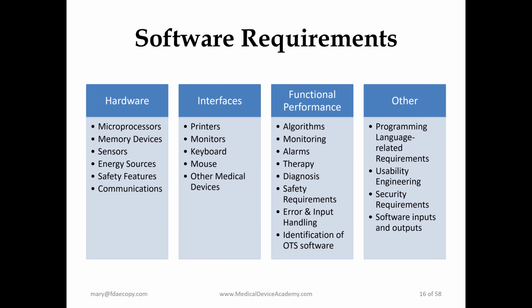Additional requirements that you want to include are your programming language and any related requirements to that. If there are any specific usability engineering requirements, or environmental considerations that you need to consider when developing your software, security requirements, how you are protecting patient data, those sorts of things.